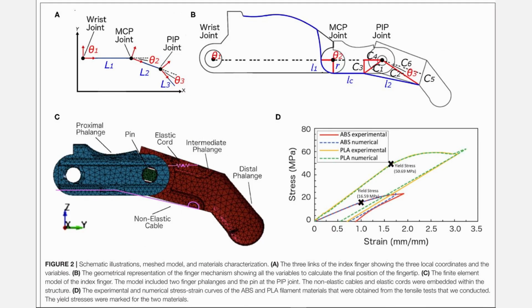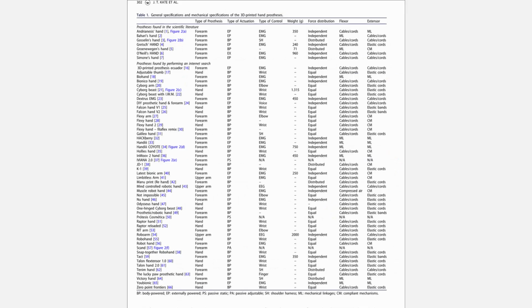All of the mentioned 3D printed prosthetics use strings to control the flexion and extension of the fingers, which are either moved by the wrist or the elbow. However, as all of these models lack independent finger control, they are all limited in their ability to grasp irregular items. We did a literature survey for this.